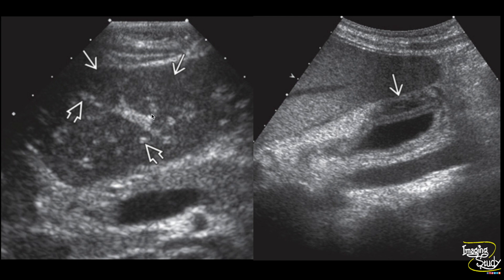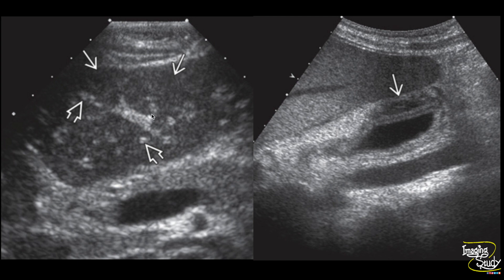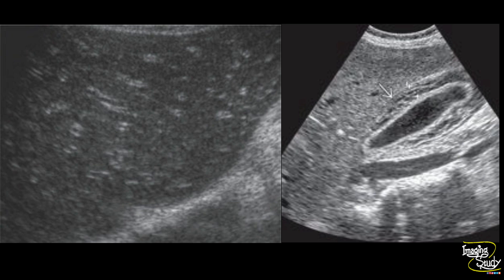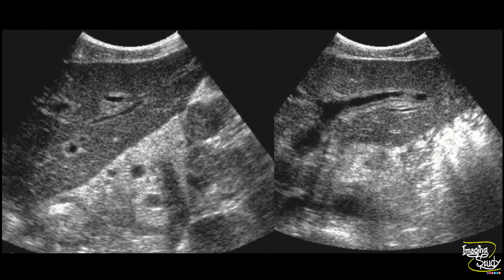Here is another view of the left lobe of the liver showing many hyperechoic foci of the portal venous walls indicating the starry sky appearance. On the right image, the longitudinal section of the gallbladder wall in a patient with acute hepatitis shows increased wall thickness due to edematous change. Here again, the starry sky appearance is visible, and on the right image an edematous gallbladder wall is seen in acute hepatitis.